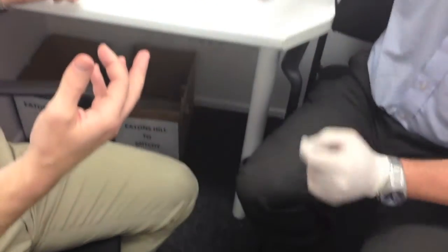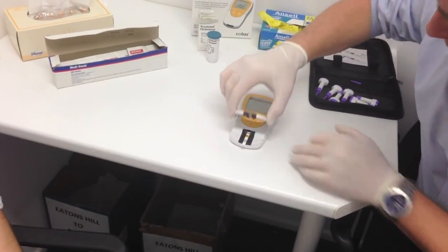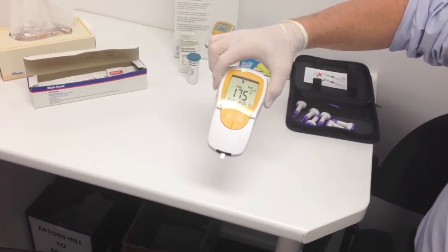We insert the strip back into the slot, close it up, and it counts down from 180 seconds — and that's it.